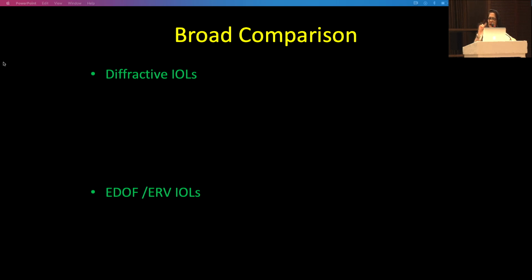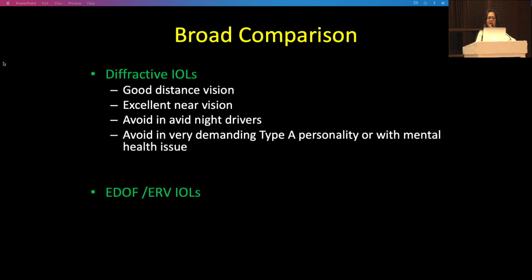We have a ready format of all kinds of lenses, and once they show their interest, then we have a detailed discussion. So I'll just summarize by giving a broad comparison between diffractive and the EDOF lenses. Which one would you want to choose?